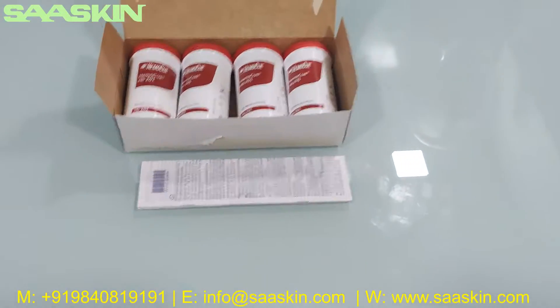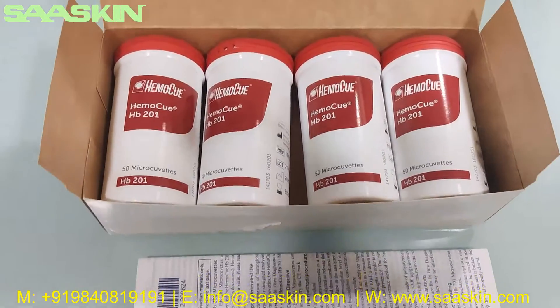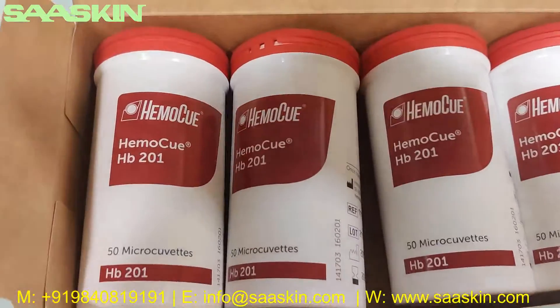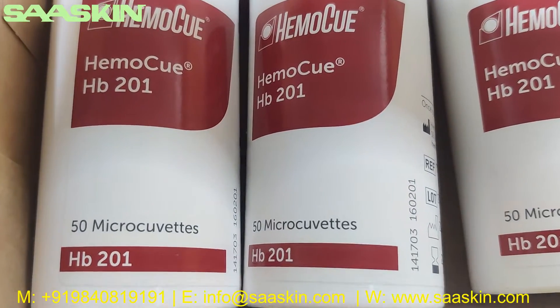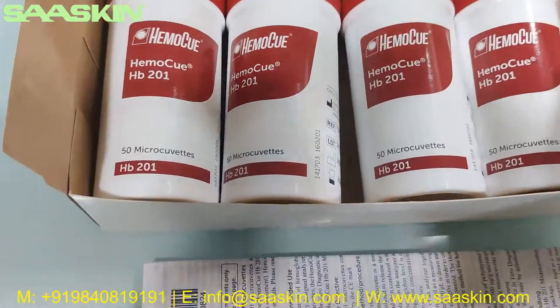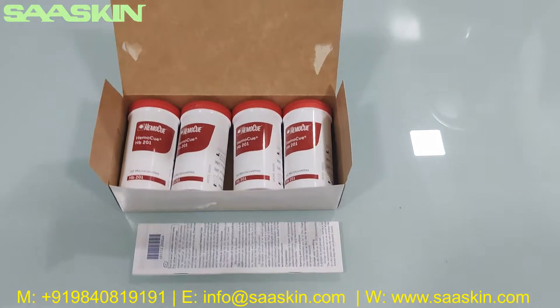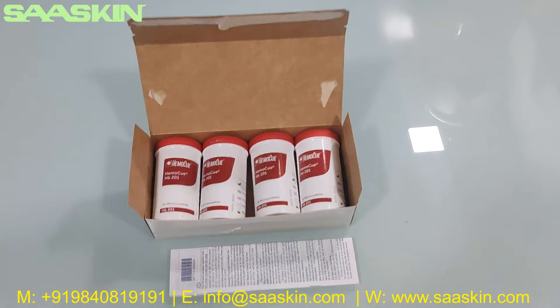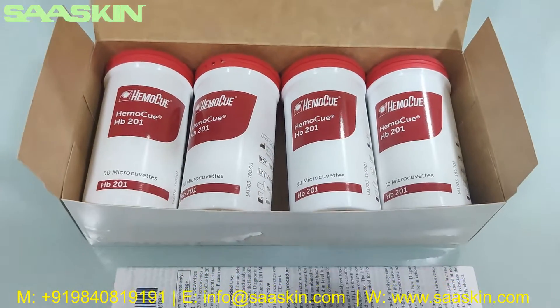To give a quick summary: these are the micro cuvettes used in the Hb 201 from HemoCue. In the test cartridges pack you have 50 micro cuvettes per sub-box, with four sub-boxes in a pack — 200 in total. That's the quick overview of the micro cuvettes used in the device. Thank you.